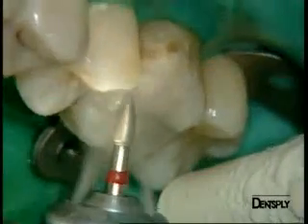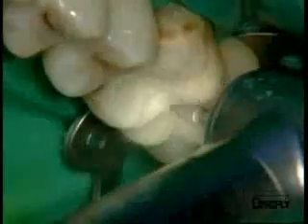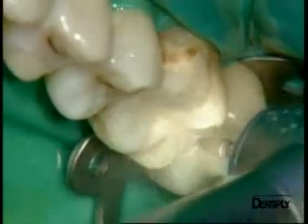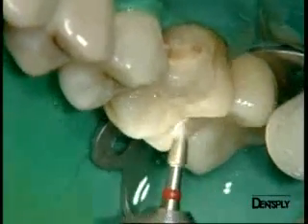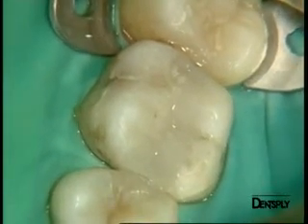The finishing of the restoration is done classically using first a finishing burr mounted on a contra-angle. This permits us to eliminate excess material and to reconstruct good occlusal anatomy. We can see here the finishing step of the second molar and the subsequent polishing.